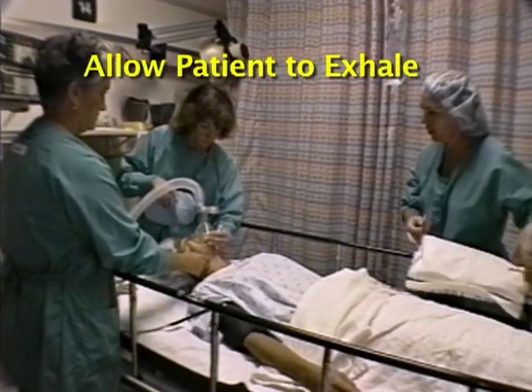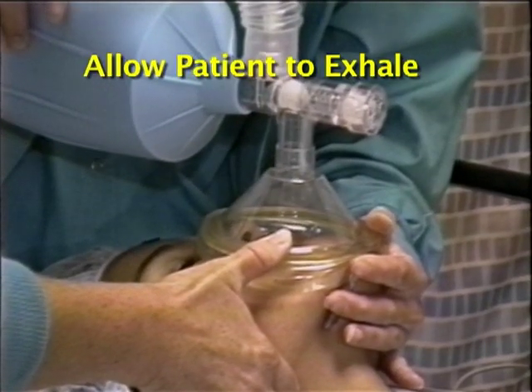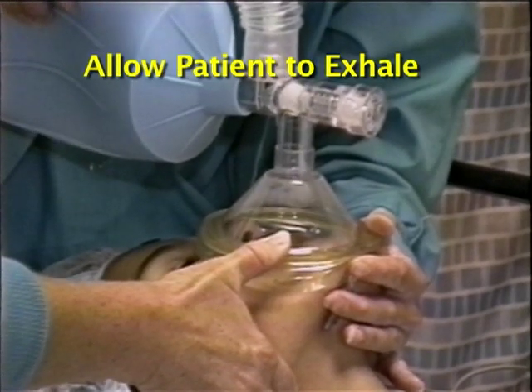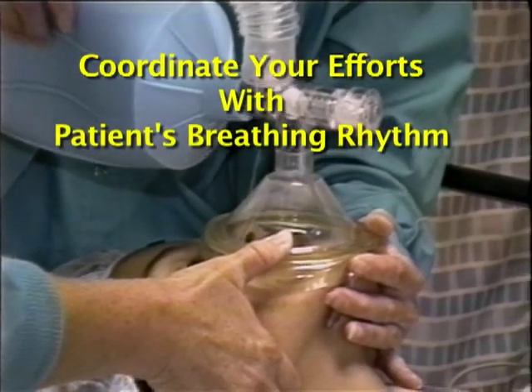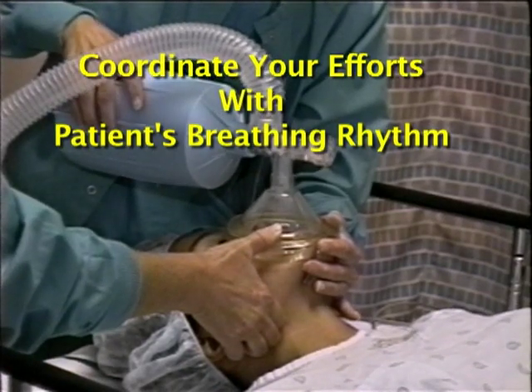Always allow the patient to exhale. If you squeeze the bag during exhalation or coughing, the gas will simply take the path of least resistance to enter the stomach or exit around the mask. Coordinate your efforts with the patient's own breathing rhythm and time your squeeze for the start of the next inhalation.